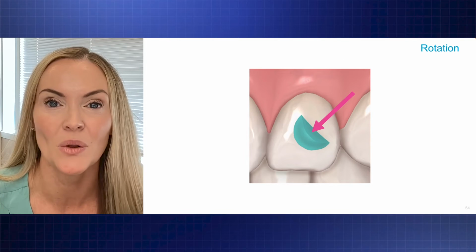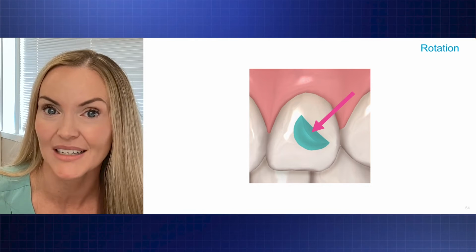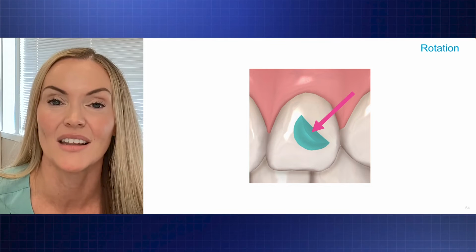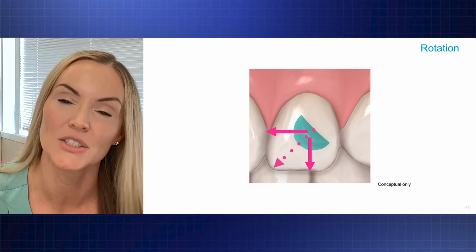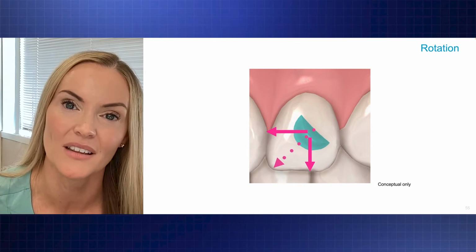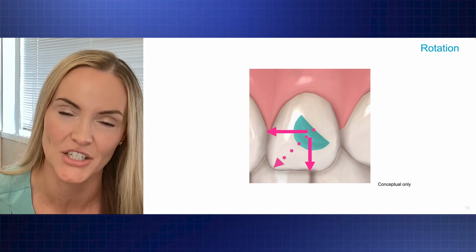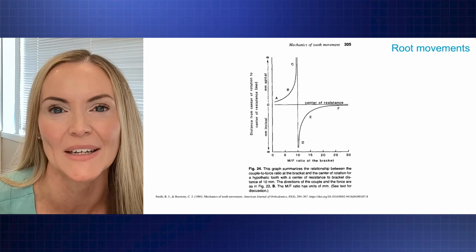As a result, we need to make sure that we place an attachment on any tooth that's rotating, not only to support the rotation and give the aligner somewhere to contact for that rotation, but also because there's a bit of an extrusive component to this attachment. You can see here the angle of that engagement of the aligner on the tooth. There's a vertical component to it as well as a rotation, and that prevents that lateral from intruding as it's being rotated.